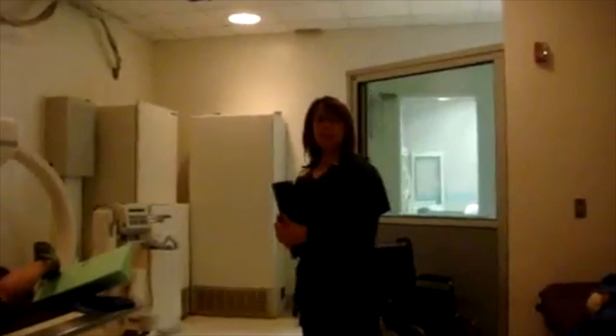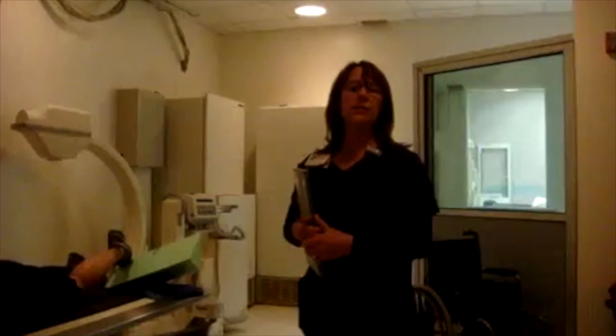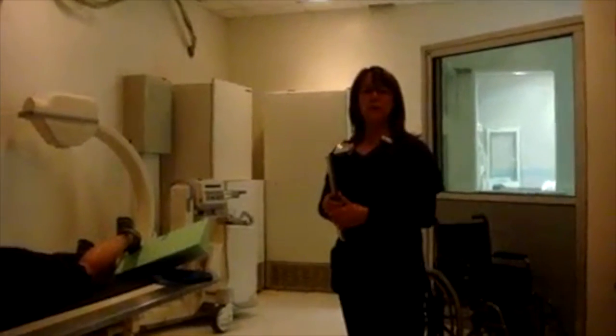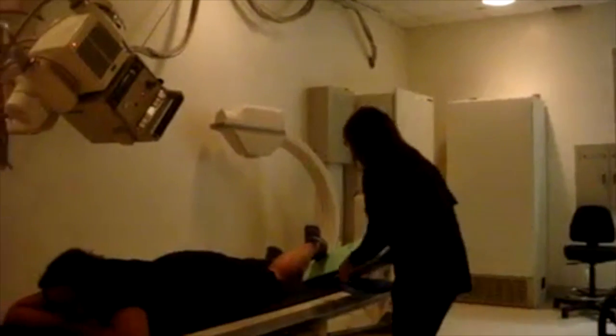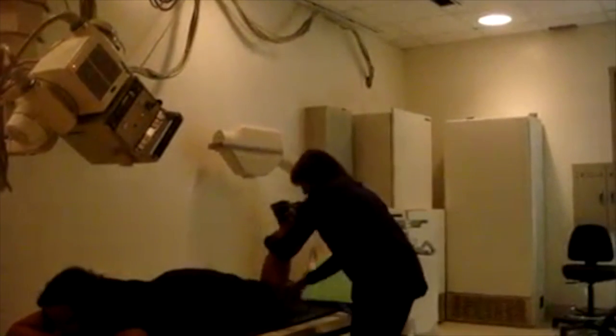All right. Okay. I've asked my patient to turn over to a prone position, and I'll be demonstrating the PA axial projection, Camp-Coventry method for the intercondylar fossa. I'm going to take my 8x10 and place it underneath the knee. I'm going to have you lift your knee up a little bit for me. Okay, go ahead and place it down.